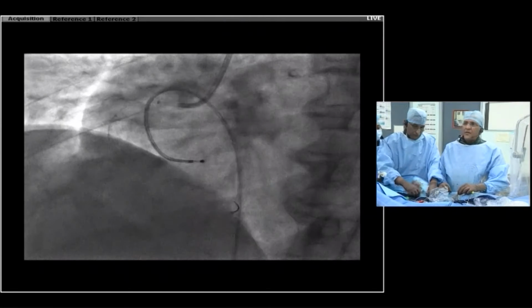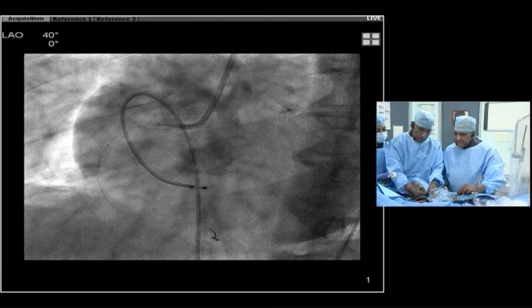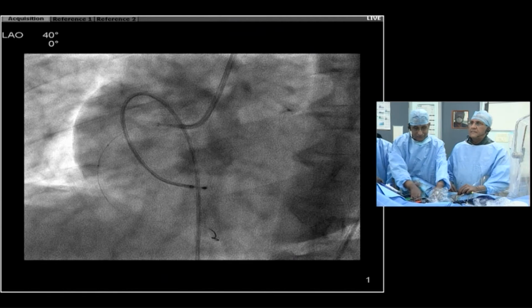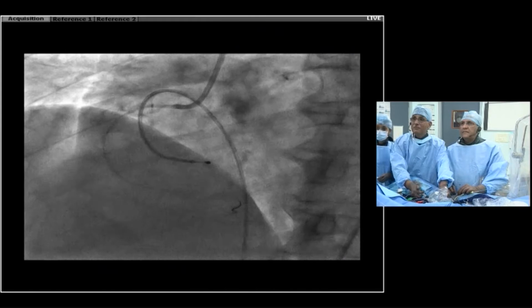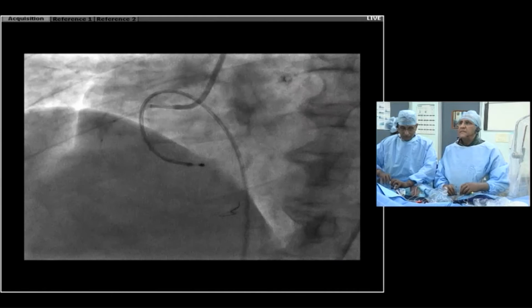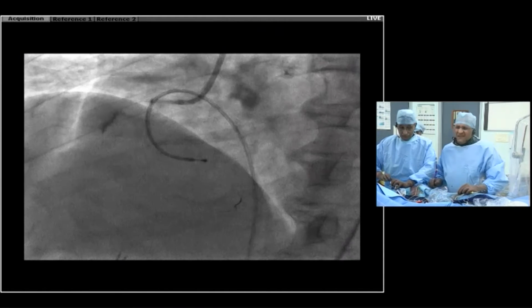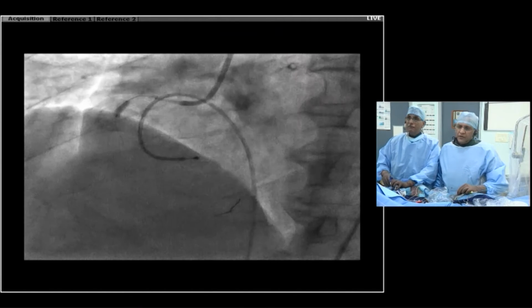I would. I don't use OPN in definitely, you should go now with a 3.0 balloon and try to open. If you don't have perfect expansion of your balloon, then the next step will be just to use shockwave. I think this is the safest way to approach this case. And Kirti, you say you don't use the OPN? If you don't have shockwave, then I would go with OPN. But I don't use aggressive OPN in my lab at all.